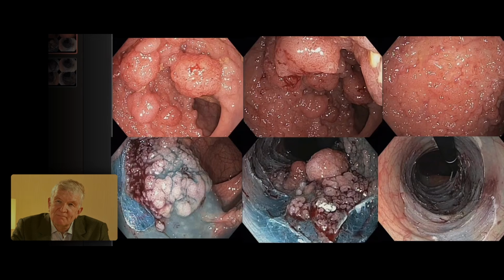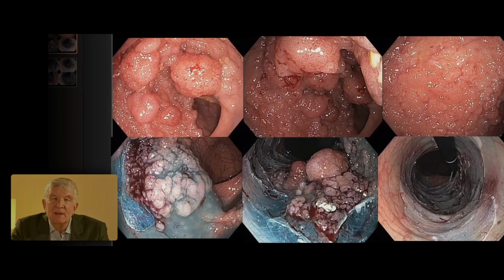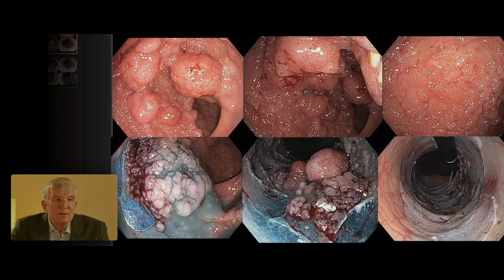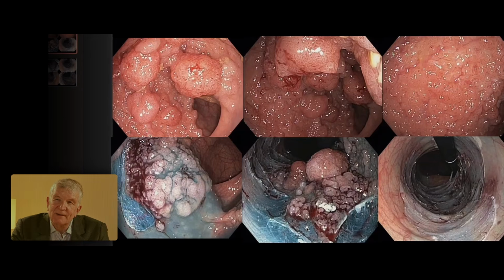Yeah, we have a paper on this coming out in GIE. Maybe you're a reviewer, I don't know. But this is another reason for recurrence. If you believe that you've removed this... It's not removed. Yeah, there's residual adenoma there. And you can see that appearance with cold snare excision now, because the plane of excision... You're taking off the grass, but the plane of excision is in the deep lamina propria, but not in the superficial submucosa.